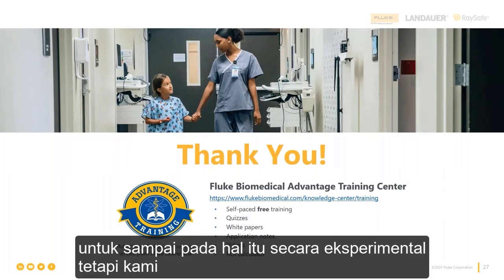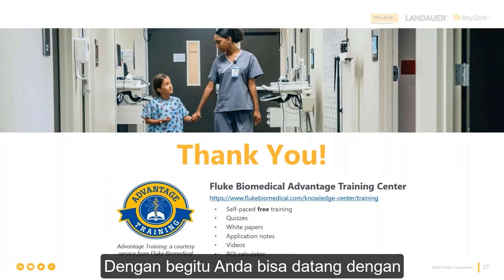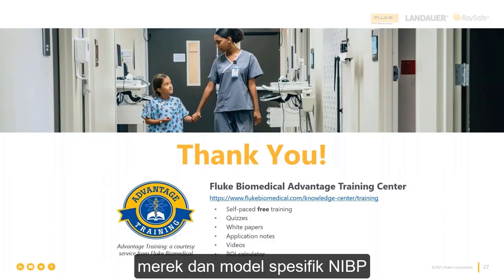You have to arrive at it experimentally, but we explain in that app note how to do the experiment. And that way you can come up with your own shift left or shift right. You can add that to your test procedure for that specific brand and model of NIBP.